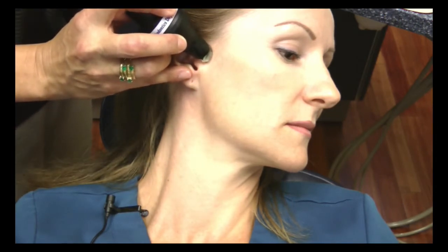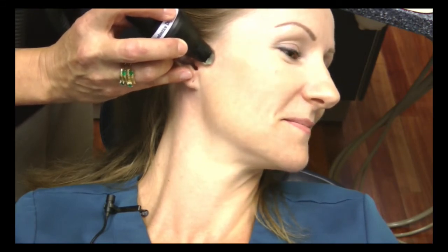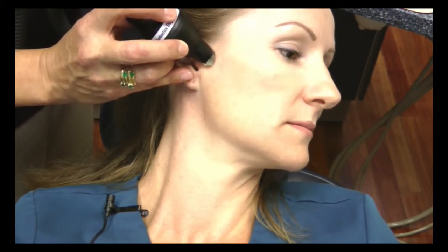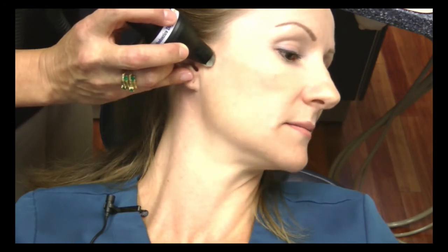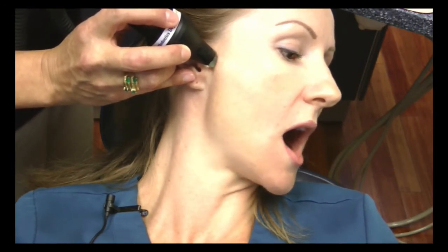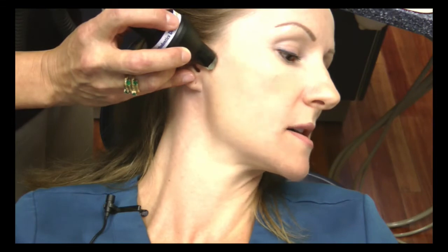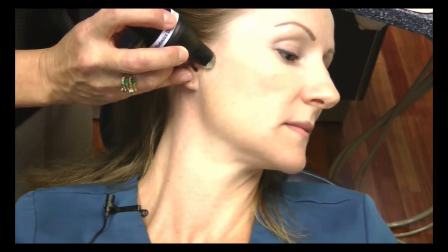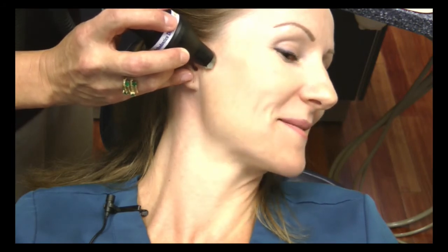Open and close three times fast. Perfect. Now open a quarter inch and close, and a quarter inch and close. Open as wide as you can and close, and open as wide as you can and close. Move your bottom jaw toward me and back, and away from me and back. Toward me one more time, and back, and away from me, and back. Perfect, thank you Shelly.